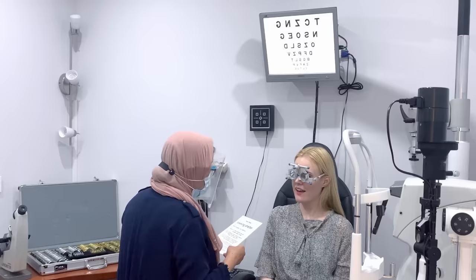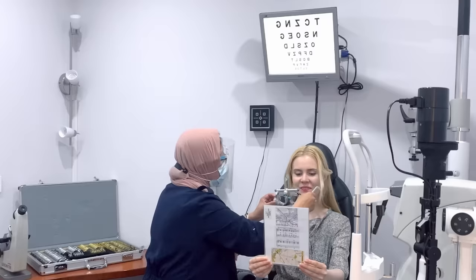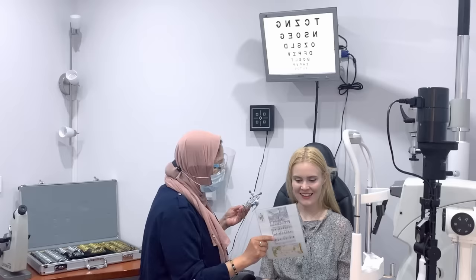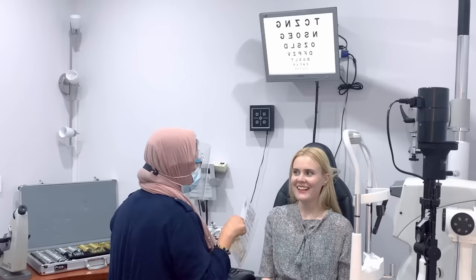So just confirming again. Stretch your arms out to where your computer normally is. Yeah. About there. You can see it, yeah? So if I took it away. Yeah. It's a lot worse. But bring it closer a little bit. Now it's a lot better, isn't it? So let's say if your computer was here or you were on an iPad, you wouldn't need this. But because it's going beyond what we call your focal length or focal point, you then need this. So you're better off probably putting glasses on for computers. But we'll discuss that at the end, in a bit more detail, yeah?